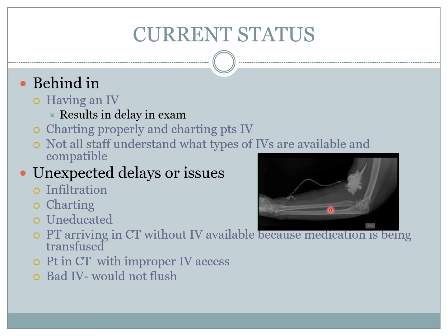Let's just assume someone shot this patient's arm. And the patient comes in, they got shot down here, or let's say they got shot up here, right? They got shot up here. There's a bullet in there, or there may or may not be a bullet in there, but it entered the patient's body. And now we need to get a CTA of their upper extremity.